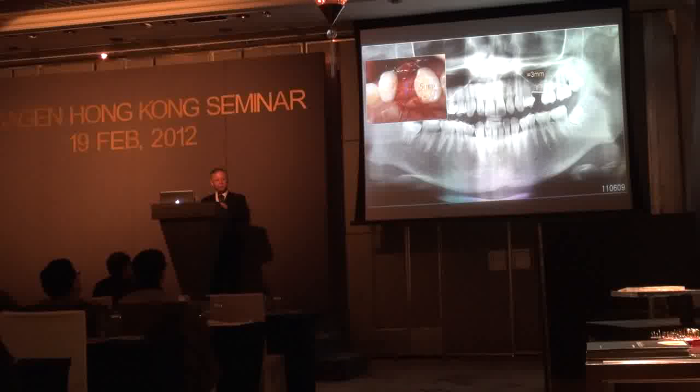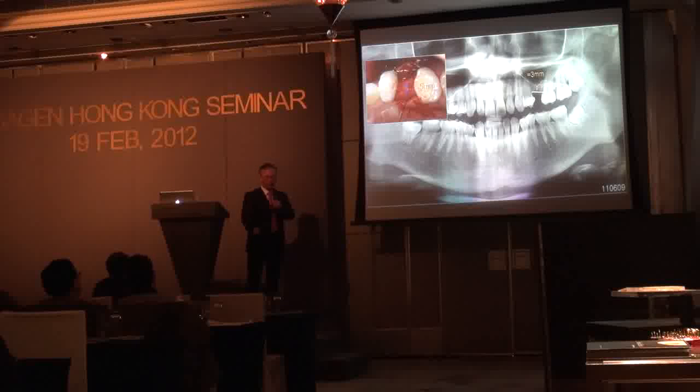So what kind of implant system do you want to use? Usually we use 5 millimeter wide diameter implants, but it's not enough. We need to make bone here, inside the sinus, but he didn't have enough time, as he had to go to the United States to study. This is my friend's son, actually.